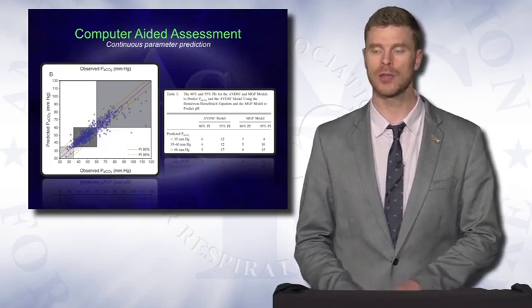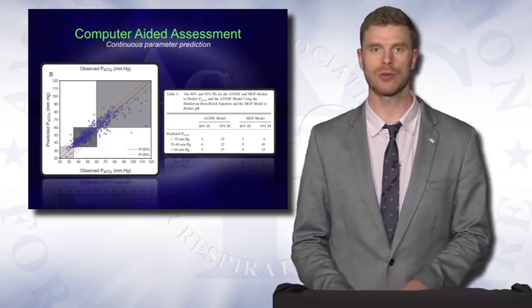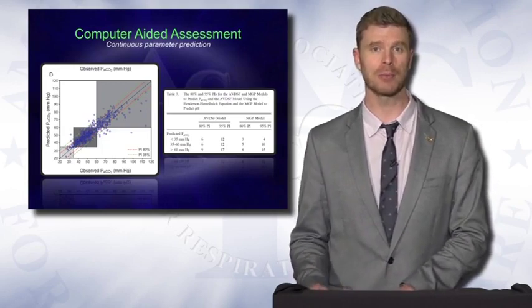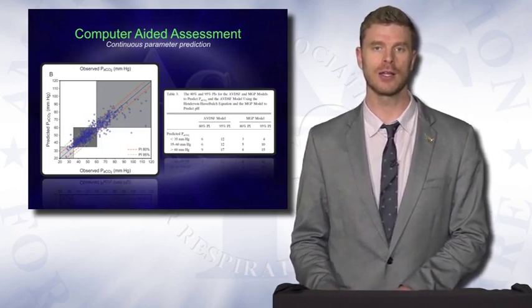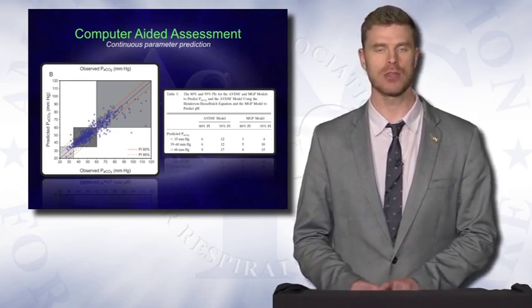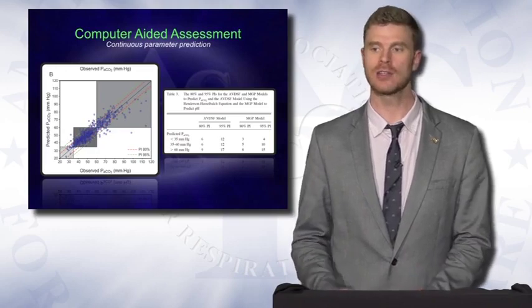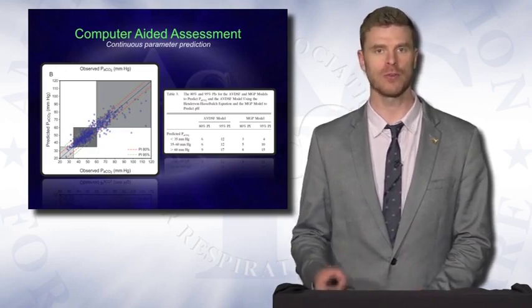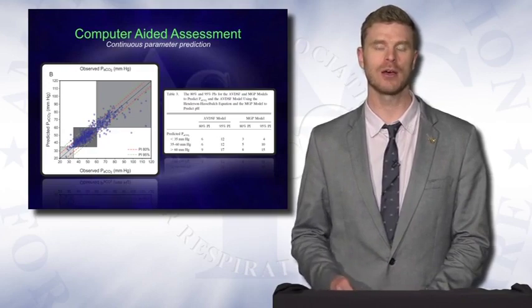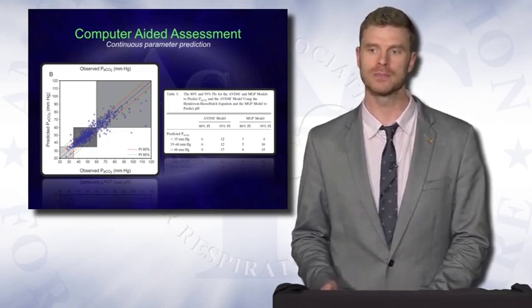So clearly, in those patients, especially with PaCO2 concentrations greater than 35, this model did not probably perform in a manner that would make it clinically relevant or applicable. However, I commend the authors for doing this work and look forward to much more work in a similar process to improve these types of models, come up with different models to get non-invasive and dynamic estimates of PaCO2 at the bedside using end-tidal and other variables.